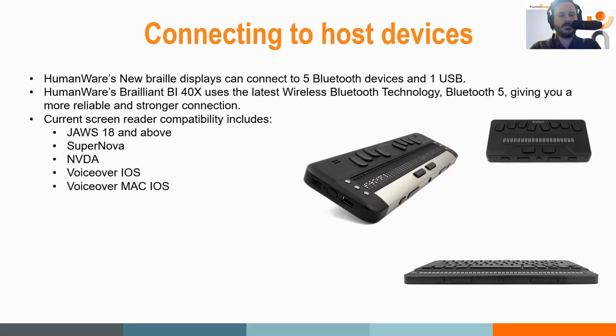So without further ado, I'm going to pass you on to Peter Tucic. He's going to talk to you about how to connect to JAWS, and depending on which version you have, it could be JAWS 18 or JAWS 19 or 20, he'll talk about how you can connect to those different versions. Then after that, he'll pass you back to myself, and I will talk about the iOS version. Over to you, Peter. I am always ready. All right, Andy.